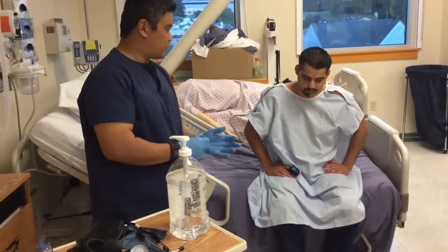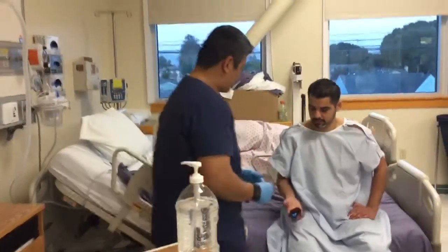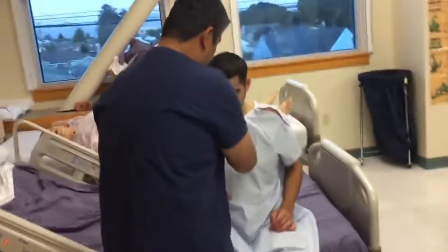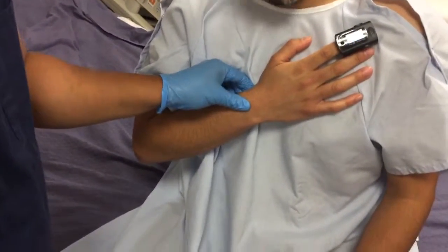So we're going to go ahead and check your vitals once more. We still have the pulse ox on there. If you go ahead and put your hands across your chest once more, we'll check your pulse and see if there are any changes.